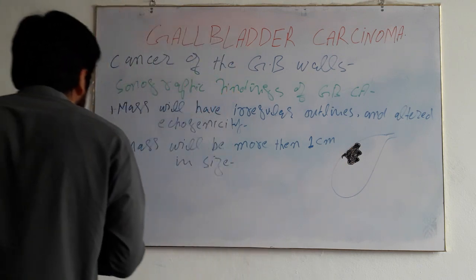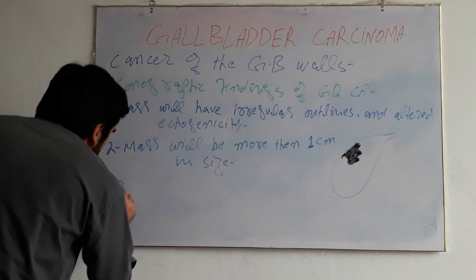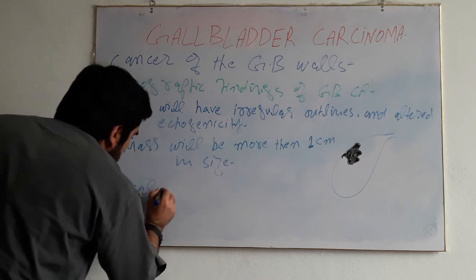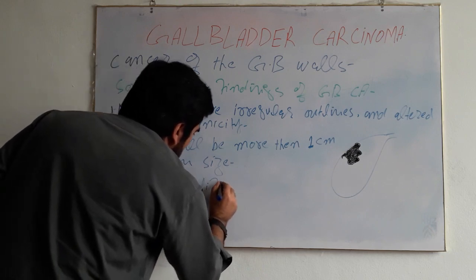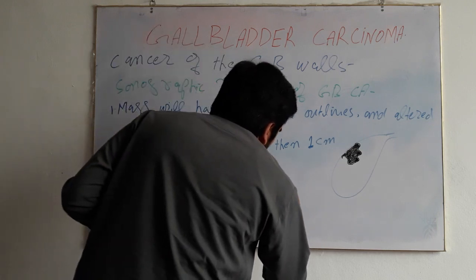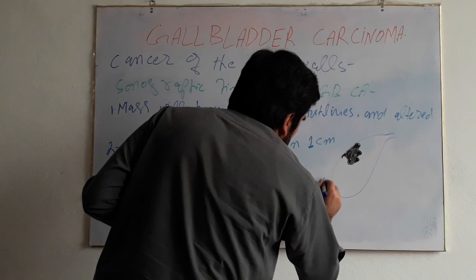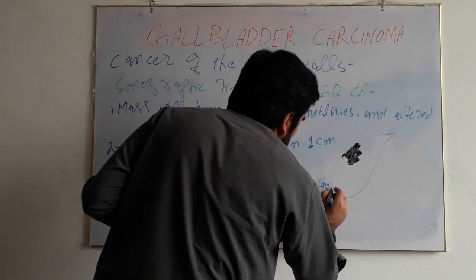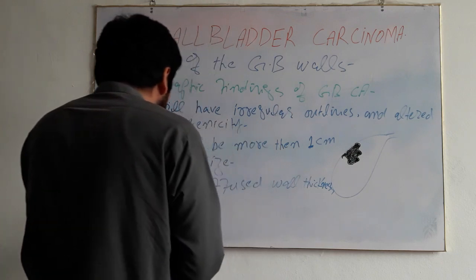Third, during gallbladder carcinoma, there will be focal or diffuse wall thickness.